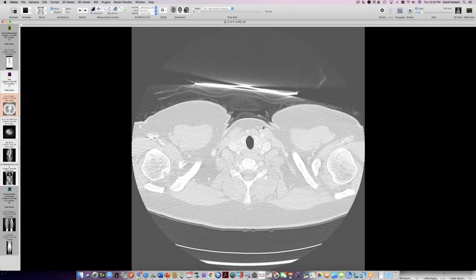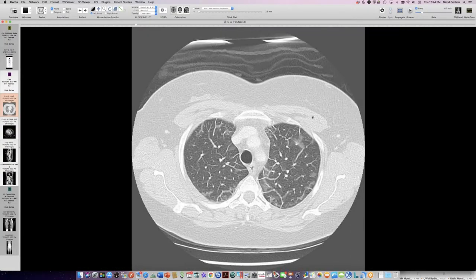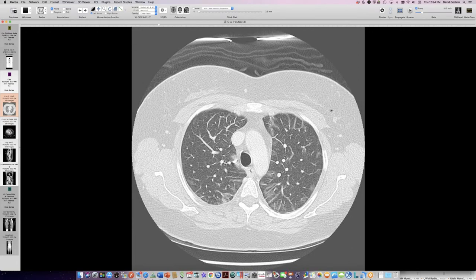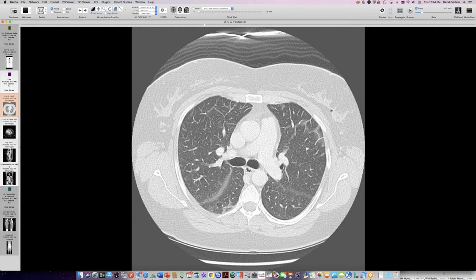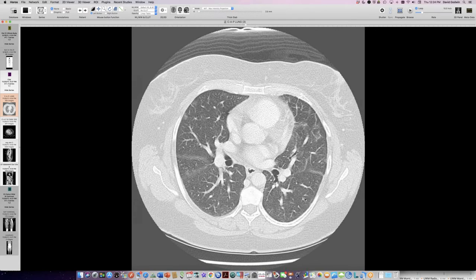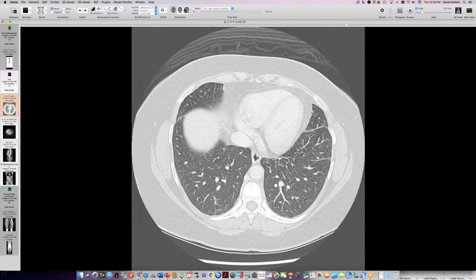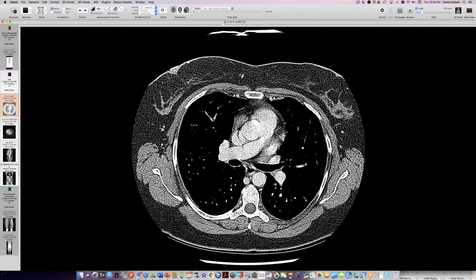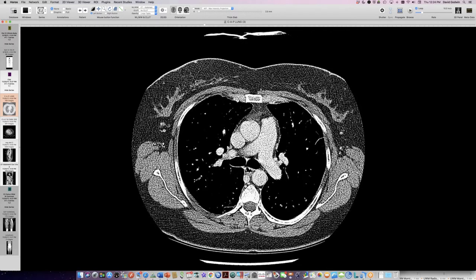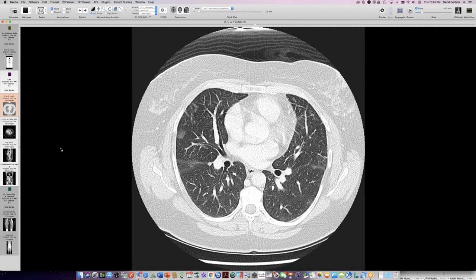So CT to the rescue. Let's see if it's real. Lo and behold, there are lots of septal lines and some smudgy ground glassy stuff too. Fat, fuzzy fissures. Bizarre distribution though for lung edema. Nothing in the way of central obstructing lymphadenopathy that might be clogging up lymphatics or veins or anything like that. Kind of hard to pin down.